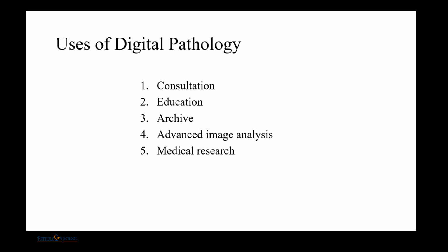For advanced image analysis, we can use software to quantify ER, PR, and HER2/neu. We can also use this for advanced studies, like to know the percentage of tumor and the glands and stroma that is present. And for medical research also, we can use this digital pathology.